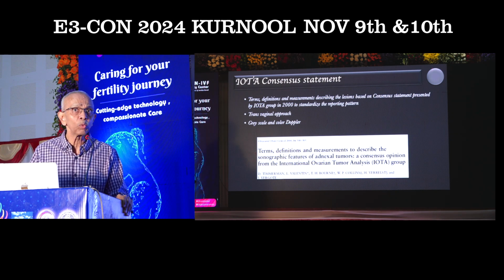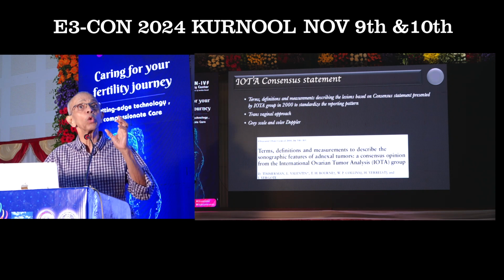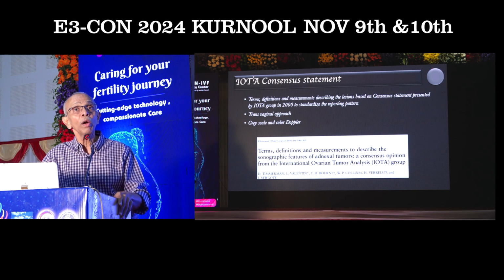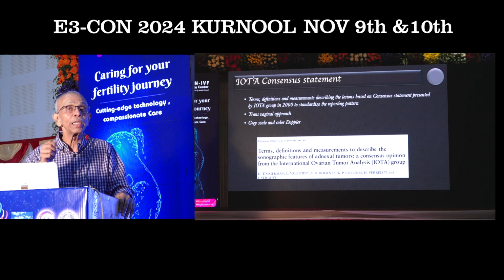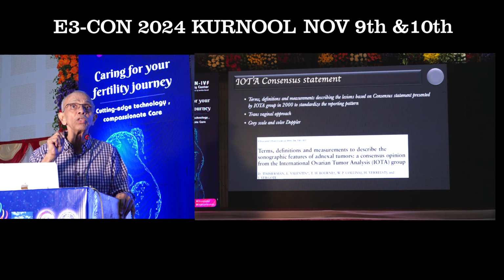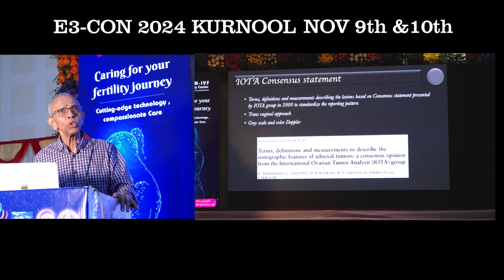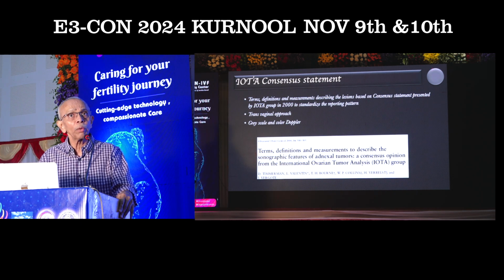Why so? The most important reason is that you are going to evaluate these adnexal lesions from a closer proximity, and you are using a higher frequency. Because you are using a higher frequency, you have a better resolution. Then you have what are called the soft markers, that is, you can mobilize the lesion, and you can use factors such as mobility as well as site-specific tenderness by doing a transvaginal scan, which cannot be done by a transabdominal scan. So these are the advantages we have, and that is the reason why they have very clearly specified that it has to be approached transvaginally.